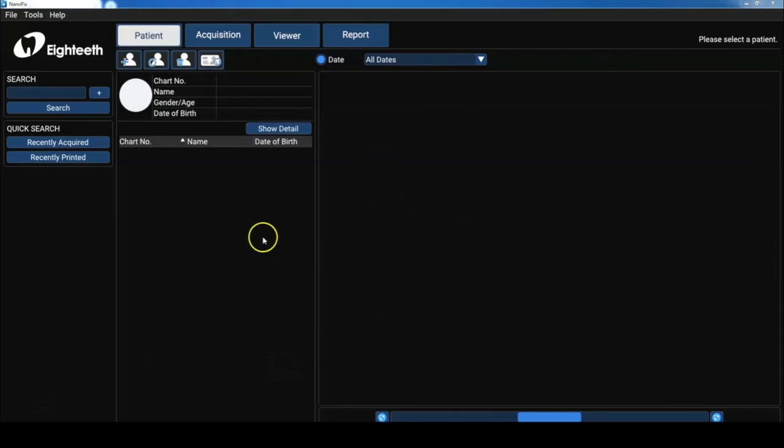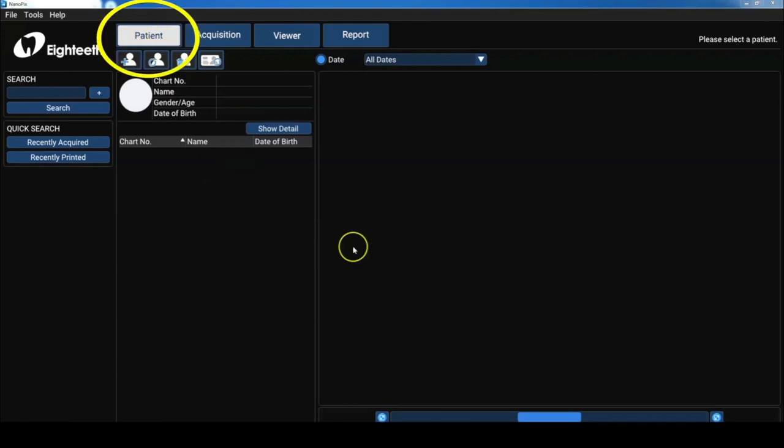Now this is truly the software's home screen. And you know that you're in the patient screen by looking at the patient tab at the top of the window.